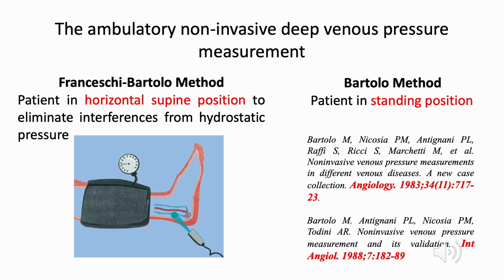The proposal of a non-invasive method to measure the deep venous pressure using the continuous wave Doppler was made by Professor Bartolo in 1983. I suggest you read the papers he published reported in this slide. Bartolo proposed the venous pressure measurement in a patient standing.